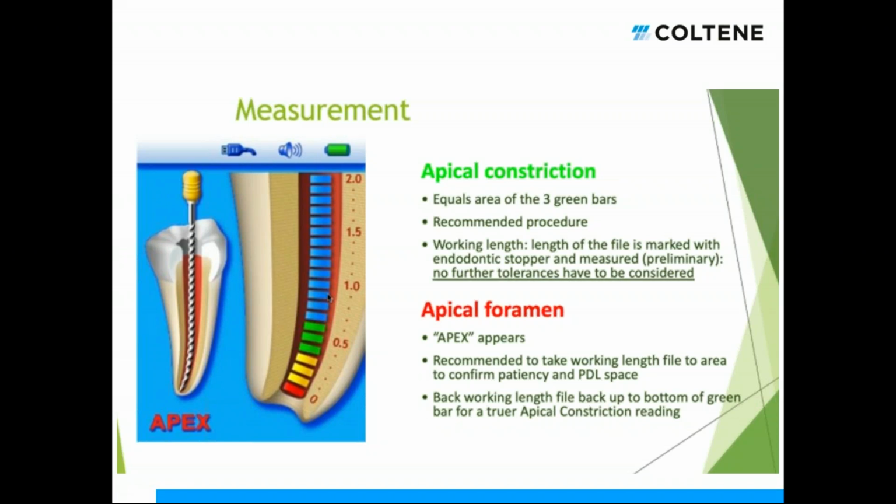But Pete, you've got to think radiographically. You're going to be looking at the bottom of that tooth radiographically, so that's going to be another like three millimeters beyond where that red dot is, don't you think? If you're looking at an X-ray. So then you would probably be about in the green zone. Yeah.